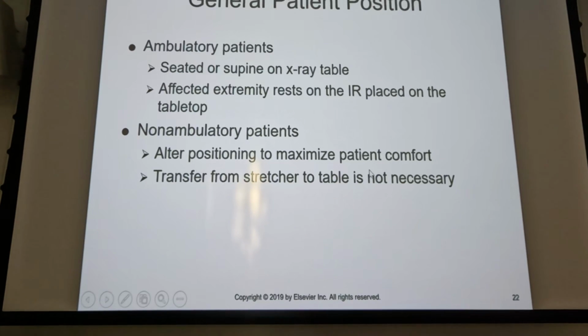If they're on a stretcher, you're going to be shooting all these on tabletop anyway, so fundamentally what's the difference between shooting them on a stretcher and shooting them on tabletop? There is none, really. Right? So is there really any reason to get them off the stretcher, put them through all the hassle and waste your time? No, not really. If it's a real busy night in the ER, is there fundamentally any difference between taking a portable to their room and doing these? The answer is no. Okay, so just some options, just some things to think about.